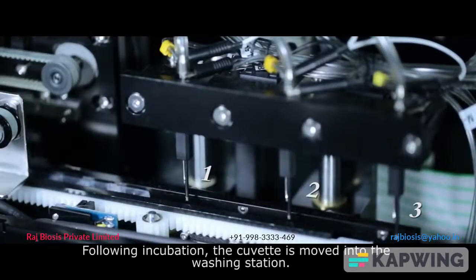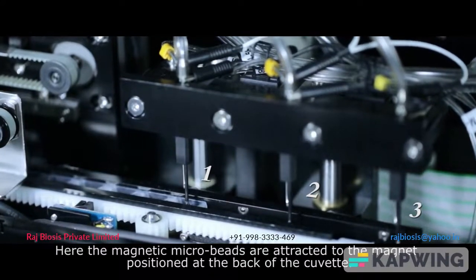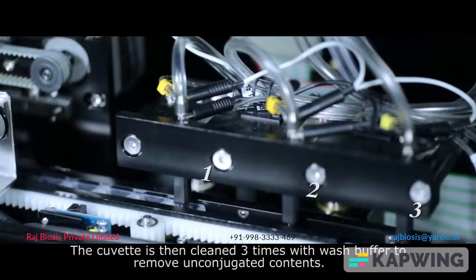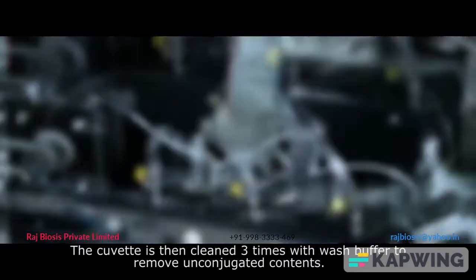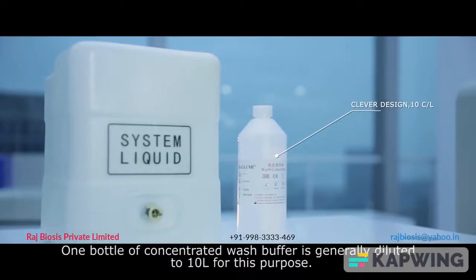Following incubation, the cuvette is moved into the washing station. Here the magnetic microbeads are attracted to the magnet positioned at the back of the cuvette. The cuvette is then cleaned three times with wash buffer to remove unconjugated contents. One bottle of concentrated wash buffer is generally diluted to 10 liters for this purpose.